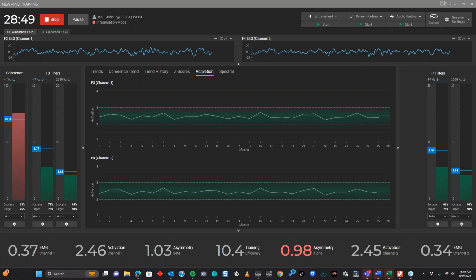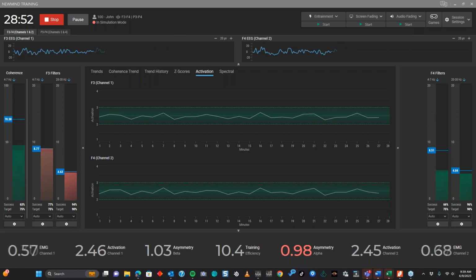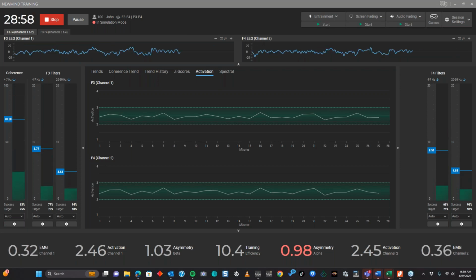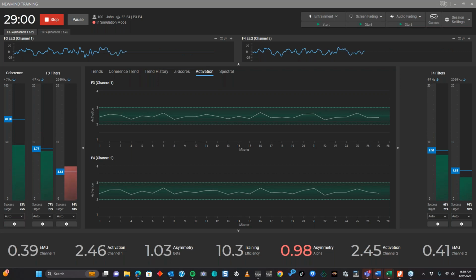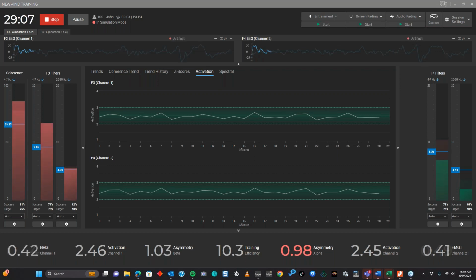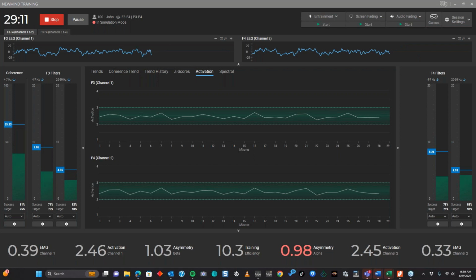I could see a foot swinging, but I never thought just a gentle toe tap would do it. Somebody could be tapping their toe inside their shoe and you wouldn't even see it, or he showed another example of hair brushing against an ear clip. So it really goes to show how little movement it takes to create a lot of excessive artifact.